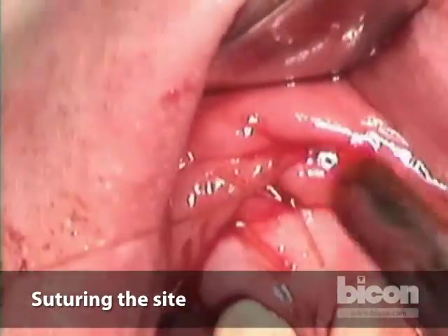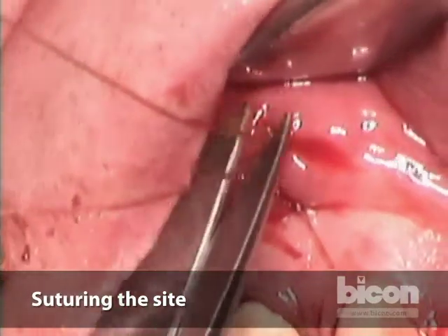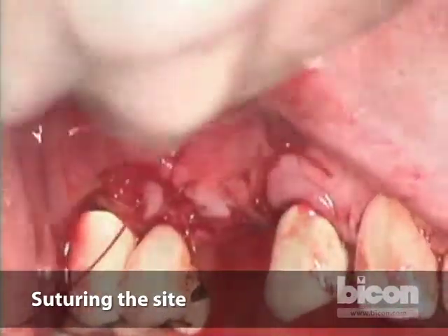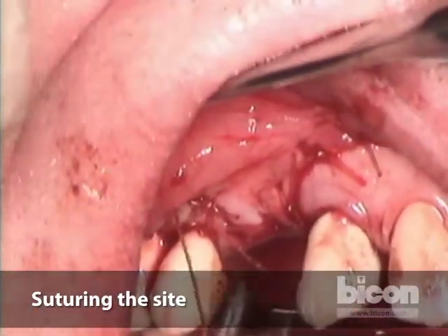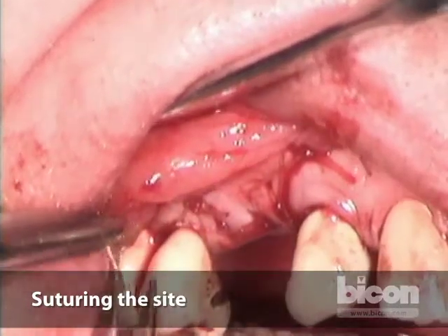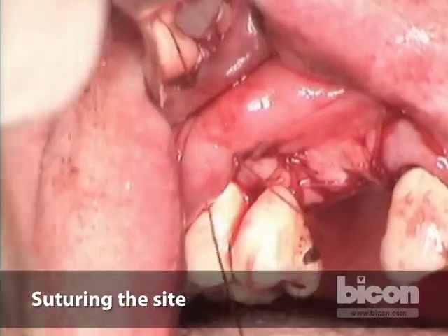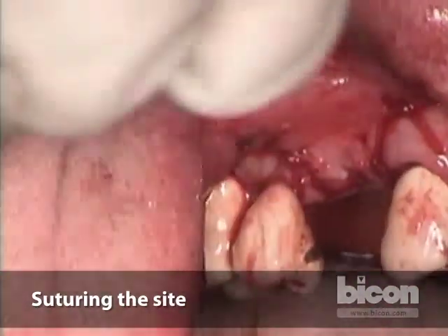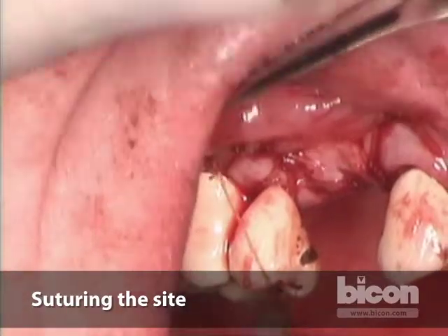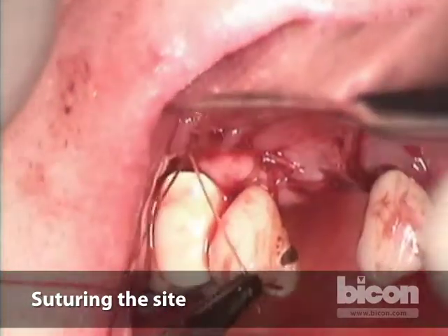Okay, just the necessary but not so very glamorous part of any surgery, and that's the closure. Hold that, please. Okay. All right. Last, certainly not least, this last suture. Okay, 1, 2, and that's it.